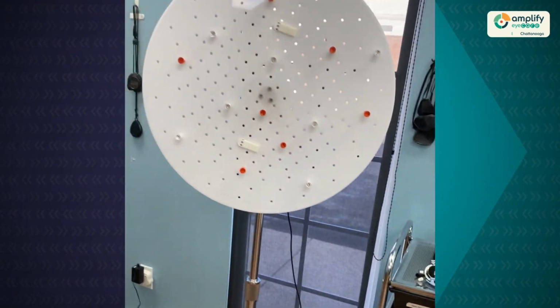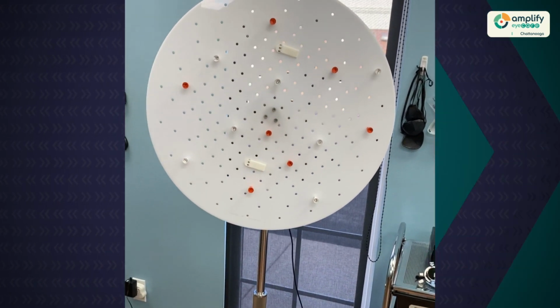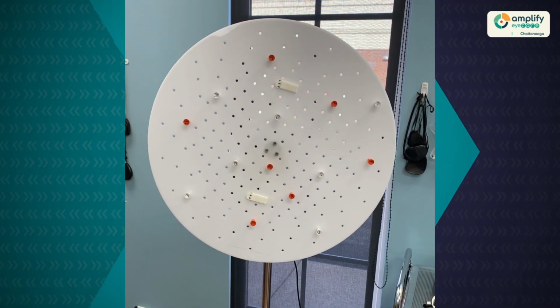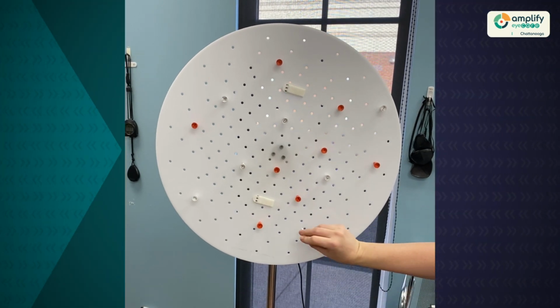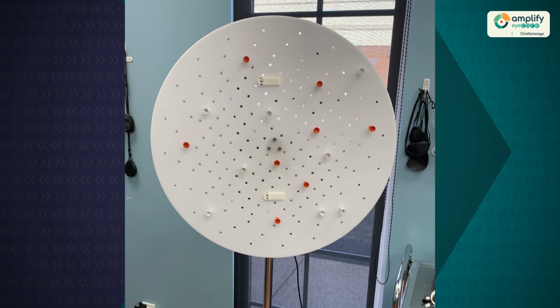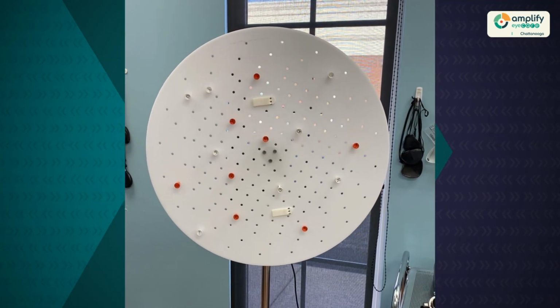We'll work a lot on ocular motility, which is the eye movements. And in these cases, we'll have the patient doing pegboard. In the beginning, the pegboard may start stationary, where the patient is working to insert the pegs into the holes without hitting the board. And then as they get better, we may turn the pegboard on to where it's now rotating while they're performing the procedure.